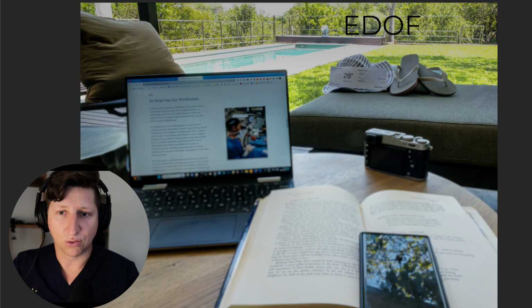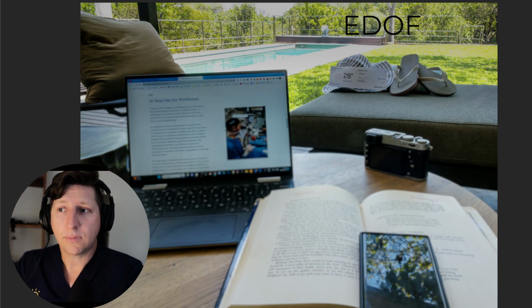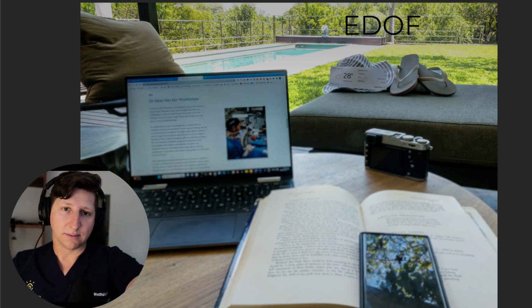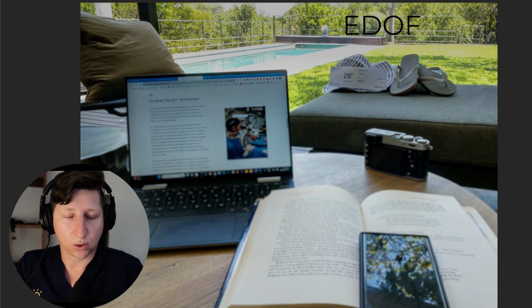Now your ability to read will probably still not be there, and one can do monovision with an EDOF lens as well. But it's a lens that gives you an extended depth of focus, but doesn't really allow you to read clearly. Maybe at long arm's length, maybe at about 50-60 centimeters, one will be able to read, but comfortable reading is not possible with an EDOF lens. And so that's when we come on to the multifocal lenses.